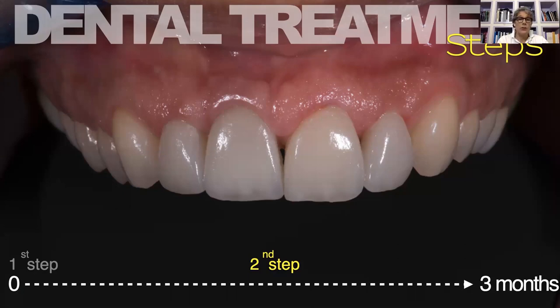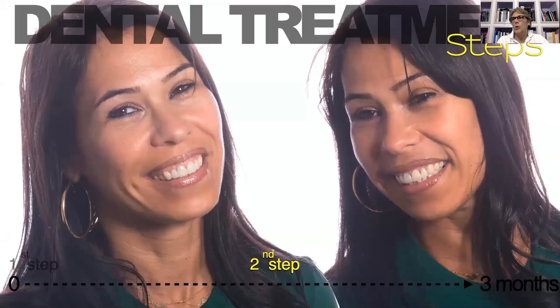in which the interdental papilla was, as usual, collapsed because the rubber dam pushed it in the apical direction, and this is a natural result, absolutely. And also the patient was fully satisfied with the final result that I was able to obtain after 2 days of work following a chairside process of work.